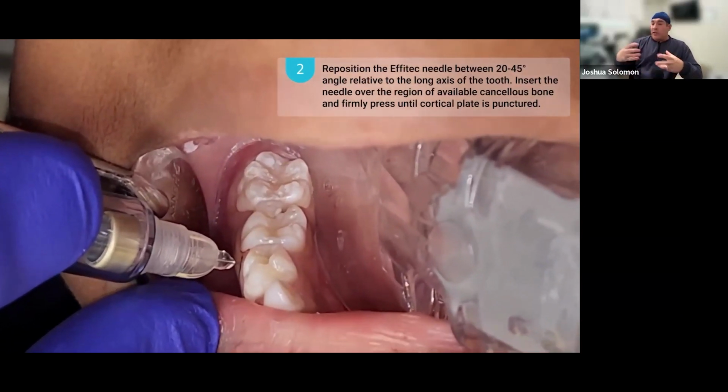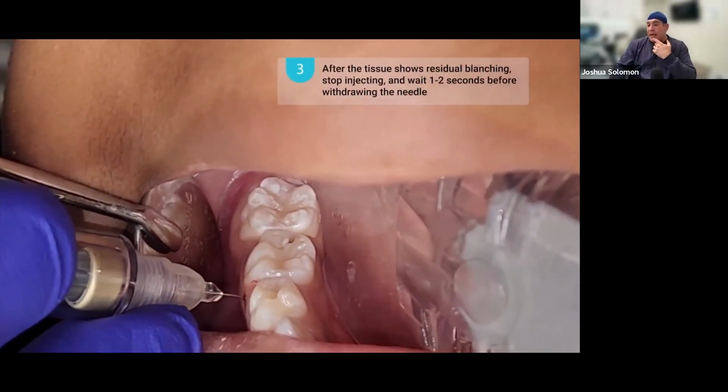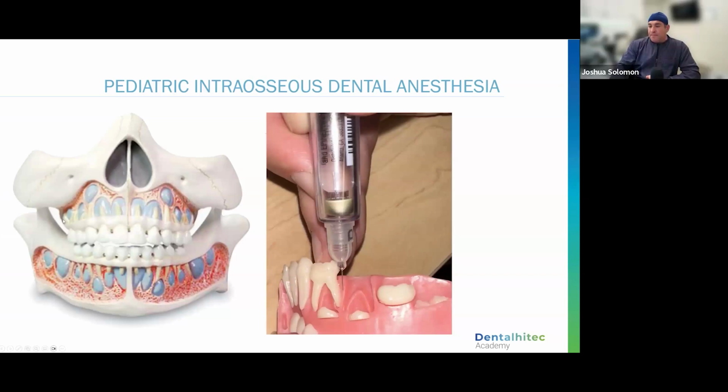When I first started this whole process in my journey, I was giving a half, and then I found I started backing up a little bit, and I just didn't need to give as much local. And there we go, our injection's done. So I would say for most patients in my office, on average, it's a quarter to a half carp in that quadrant. We're using a 9 millimeter needle here.